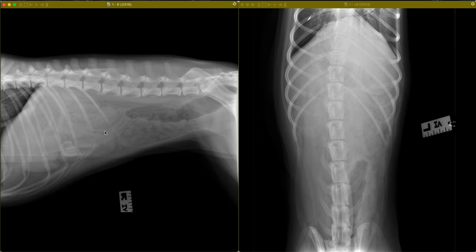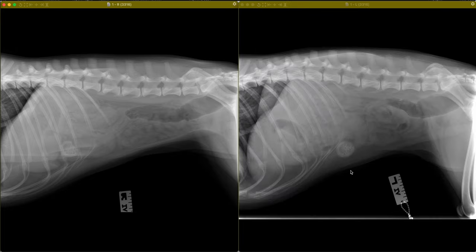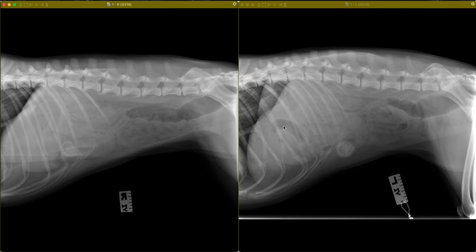In this exam, we get great benefit from using a left lateral view as well as a right lateral view. The gastric silhouette is moderately distended with gas and soft tissue. On the right lateral view, the gas cap is in the fundus of the stomach, and on the left lateral view, the gas distributes a little bit to the region of the pyloric antrum and then also out through a moderately distended proximal duodenum.